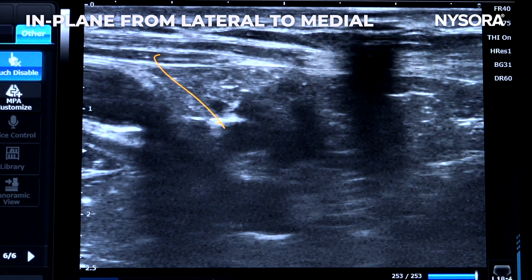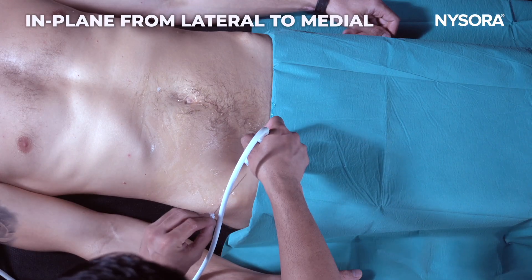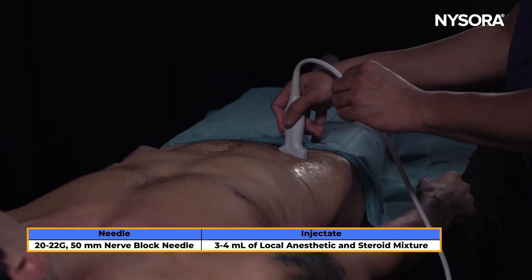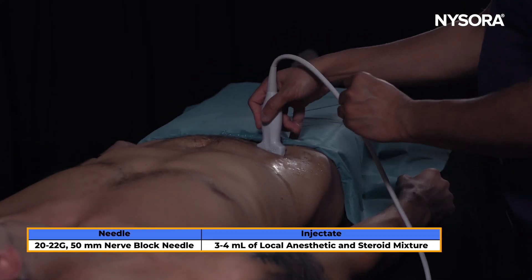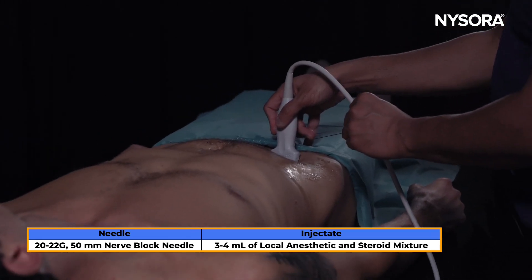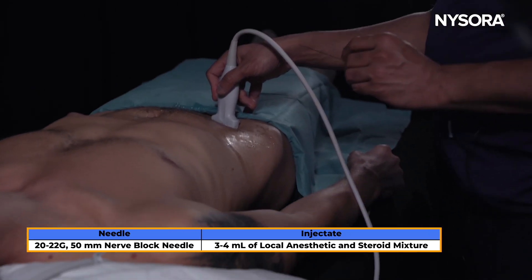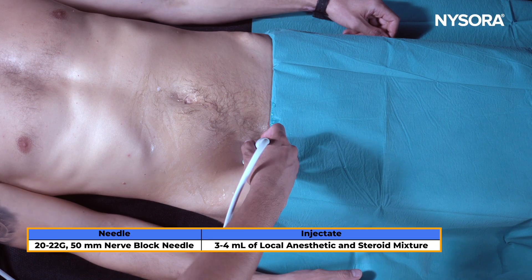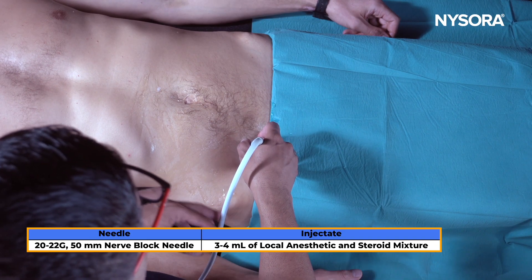The needle approach targets from lateral to medial using an in-plane technique. You can also block this nerve out of plane; however, given that it's a vascular structure surrounding the nerves, an in-plane technique is preferred so you can manipulate the needle precisely and localize the needle tip accurately.